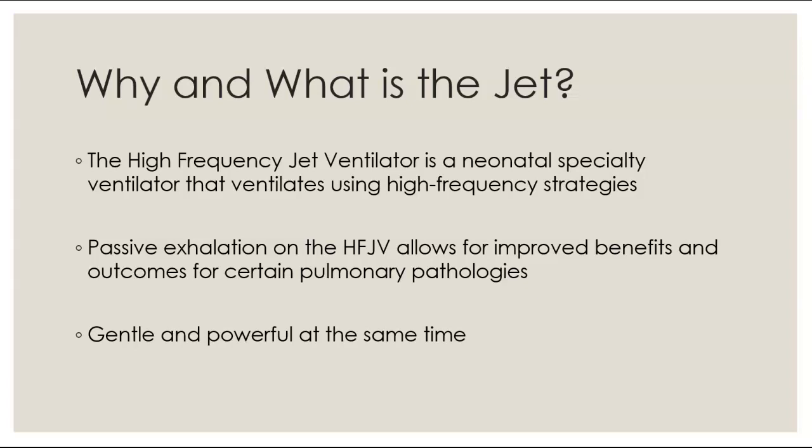One thing with a jet is it allows for passive exhalation, which can be of improved benefit for certain pathologies such as air leaks that might come from, say, too small of a tube or a pneumothorax, anything like that. And also for premature lungs, PIE is a huge indicator for the jet. I like to think of the jet as gentle and powerful at the same time.